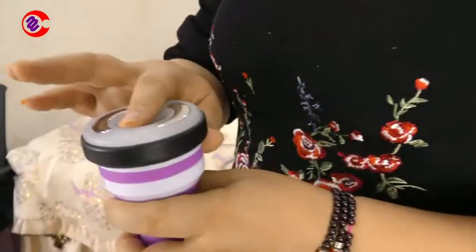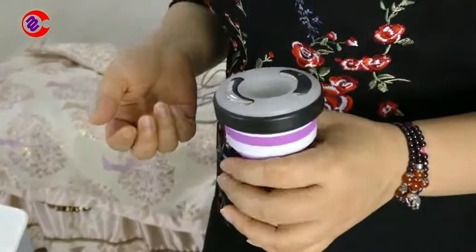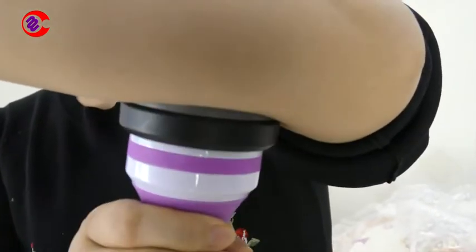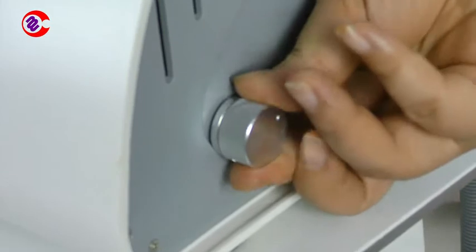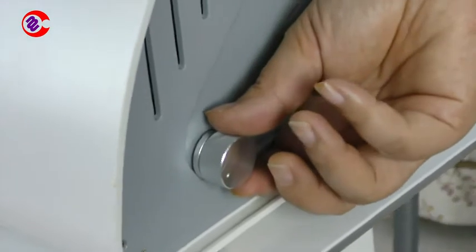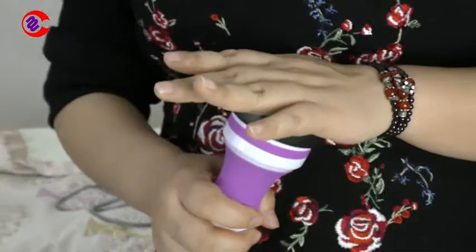Sometimes people will test it like this — there is no suction, and that is wrong. If you test like this, it is wrong. How do we test the vacuum? Sometimes we can use this arm — you can see. This one is the vacuum suction adjustment button. If you feel the suction is slow or too weak, we can adjust the vacuum suction. Normally we test the vacuum by the abdomen.